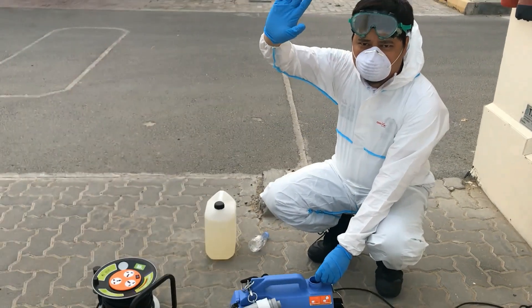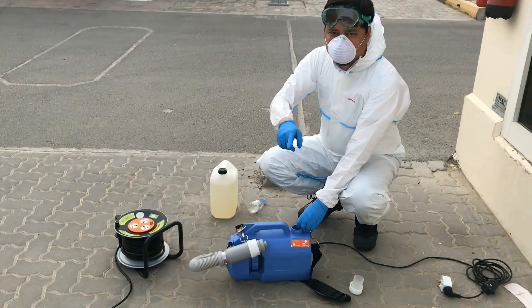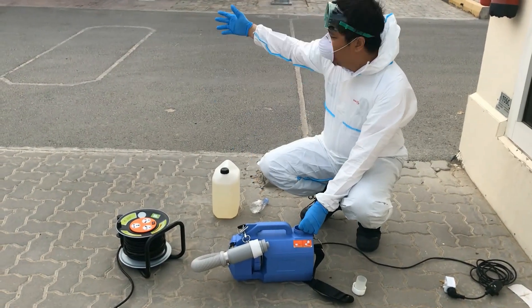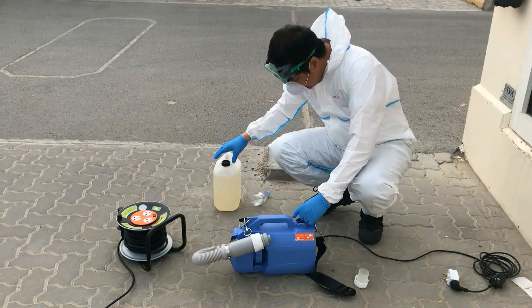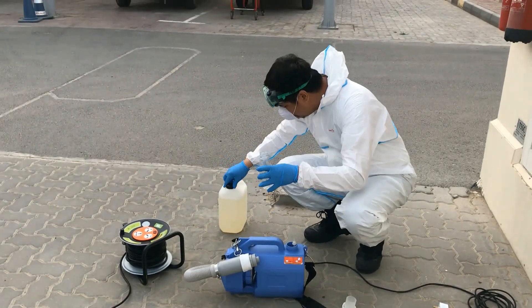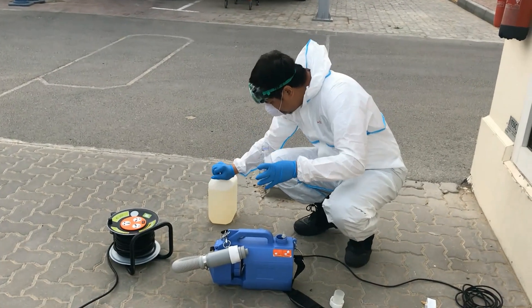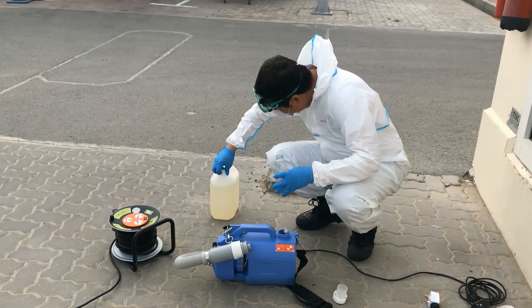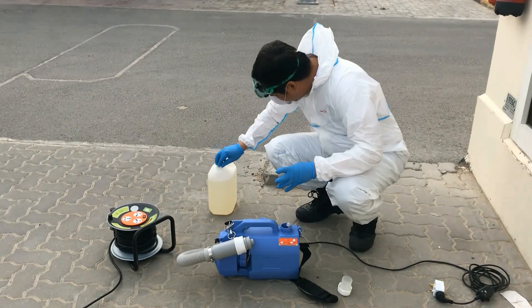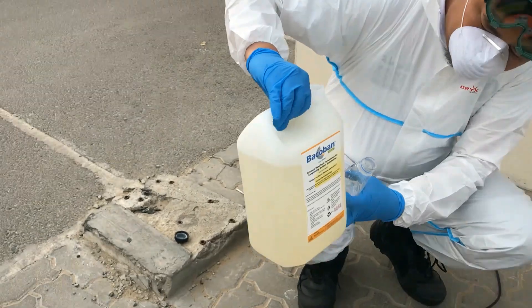Hello, good morning mga amigo at amiga! Today we will show you how to mix the solution for the tagging of our ambulance. We need two bottles of this solution. Let us see the solution — ito yung solution namin.